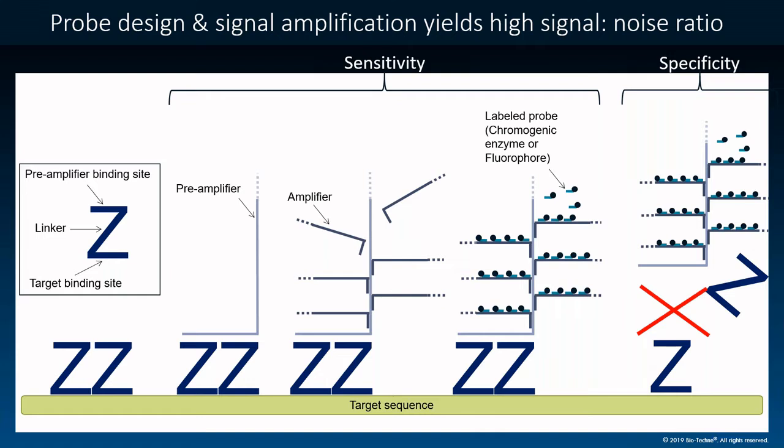And consequently, no amplification of any non-specific hybridization will occur, generating little to no background signal. So a standard RNAscope probe, if you order, will consist of about 20 of these Z pairs pulled together that are designed to hybridize next to each other along your gene of interest, giving you a tremendous amount of amplification and signal potential.